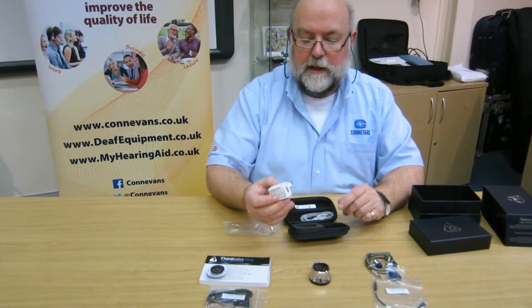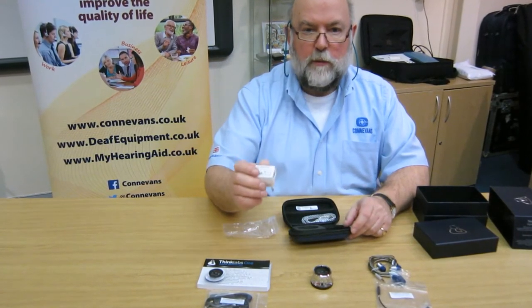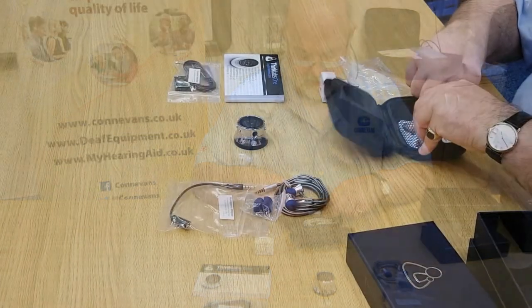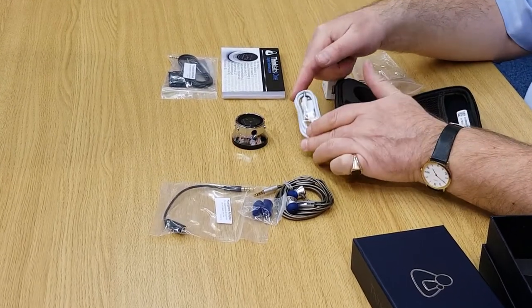Because it's an American product, it comes with an American USB charger. So we will be substituting that and making sure that when it arrives on your desk, it comes with a UK supply. And in here is the USB power supply charge lead.